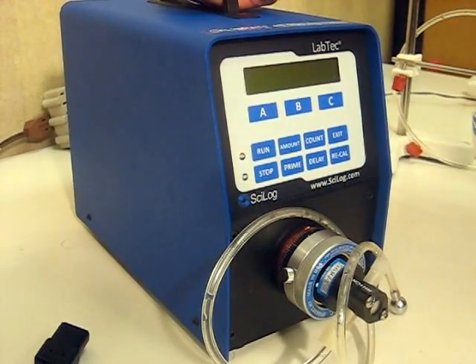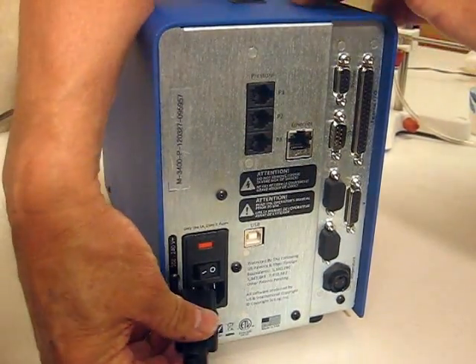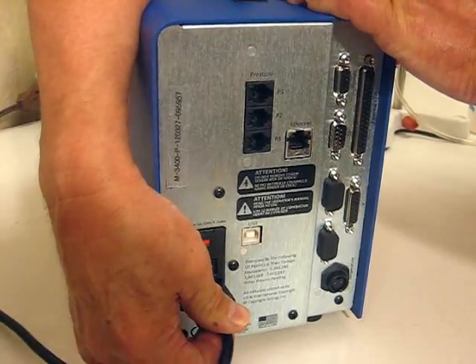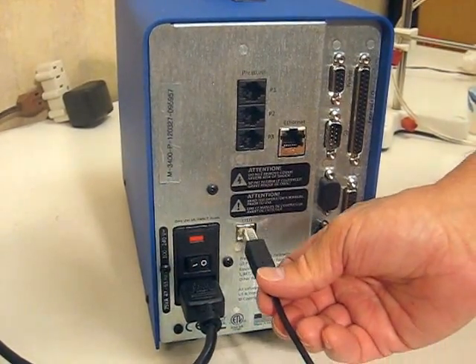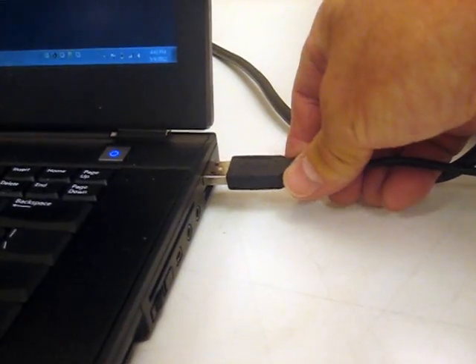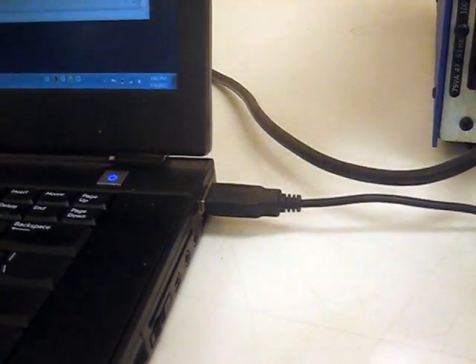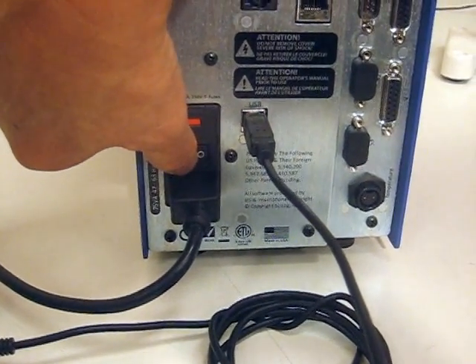Hooking up the system is very easy. First of all, you turn the Labtech Methadone pump around. We have a power cable that we plug in at this location. And then you have one end of the USB cable that plugs in directly at this position, and then the other end of the USB cable plugs into a location on your PC. Once you have those hooked up, you can then turn on the power switch of the Labtech Methadone pump.